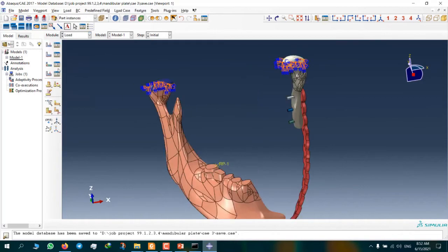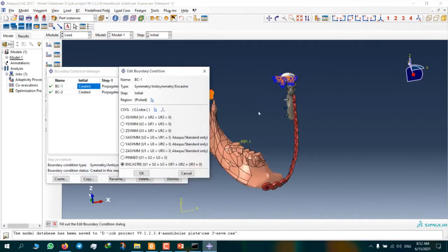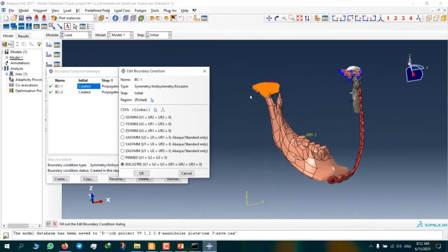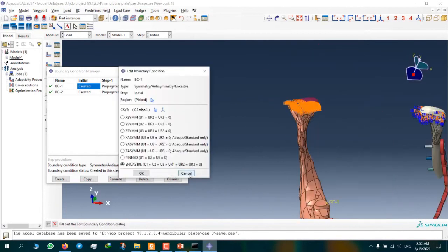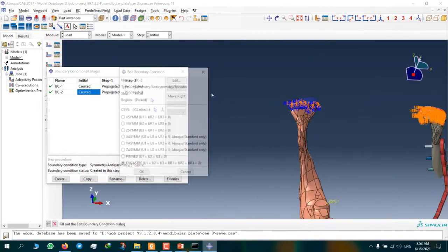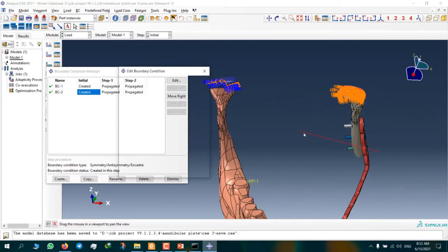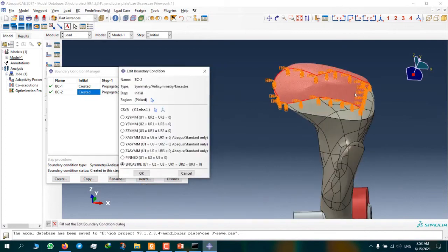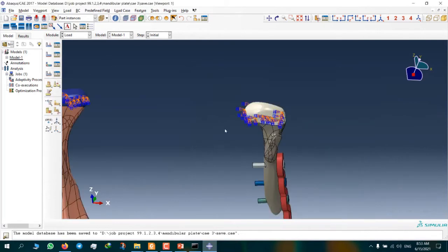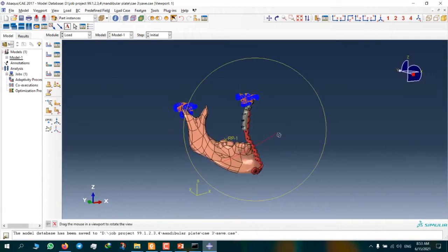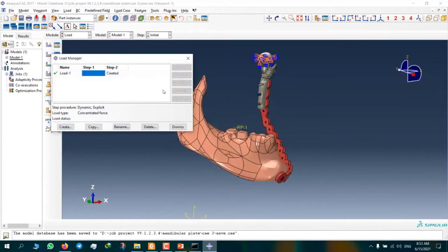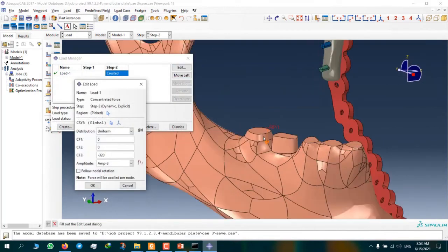And here we have boundary conditions. Boundary condition number one is for the right side, and boundary condition number two is for the left side. And here we have loading, minus 320 on a molar tooth.